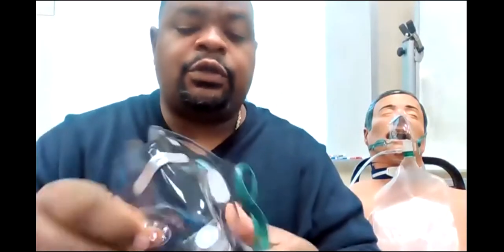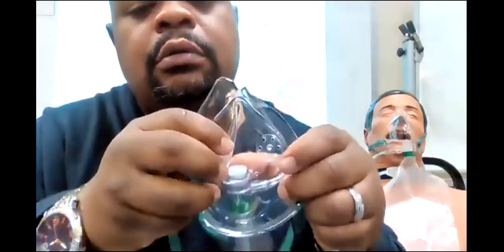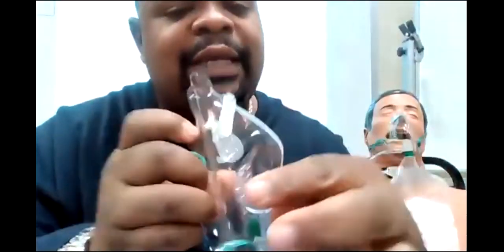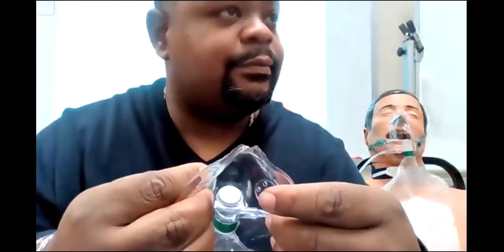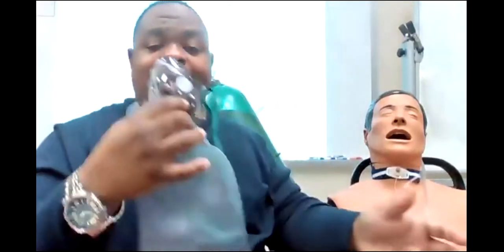But when you buy it in the store, it's on there. So you have a one-way valve here. You probably can hardly see it, but that's a valve there that blocks your air from going in. You cannot breathe into this bag. Then you have two one-way valves on the exhalation ports, one of which is usually removed for safety. Okay? This is a non-rebreather mask. I can get FiO2s from about 70 to 100% at flows of 8 to 10 liters. So say Mr. Johnson is on this non-rebreather, and he's inhaling, and the bag is collapsing. What do I do?